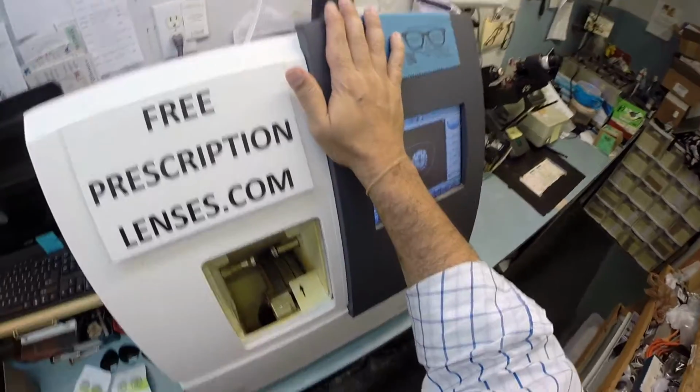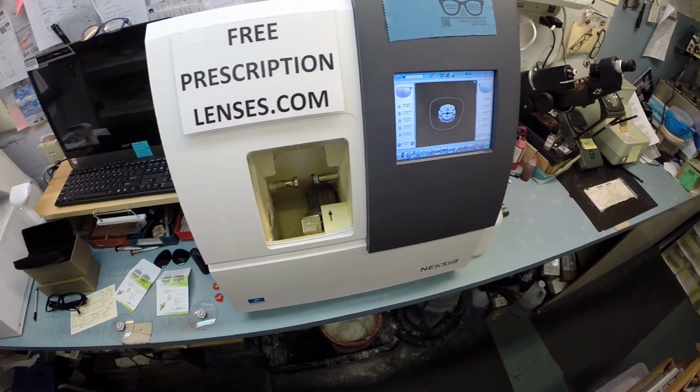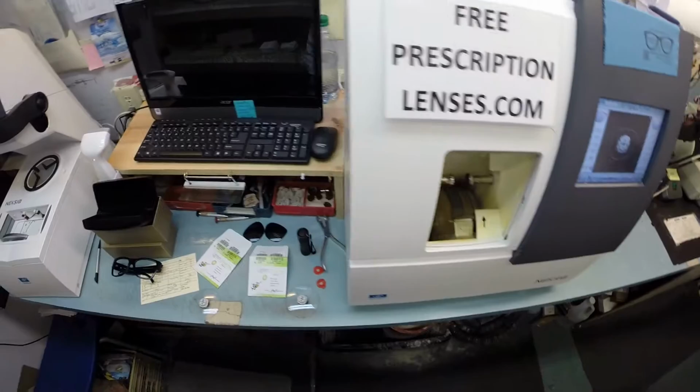Now, this is the edger. This is what costs $40,000. It weighs 200 pounds. I recommend everyone go out and buy their own. And then you won't need this guy anymore to cut lenses for you. And I can take the evening off. But that ain't going to happen.